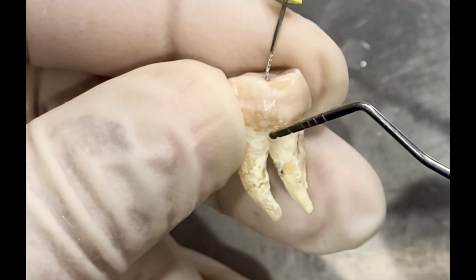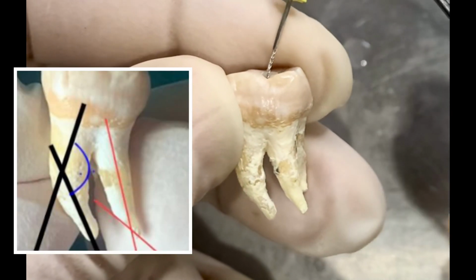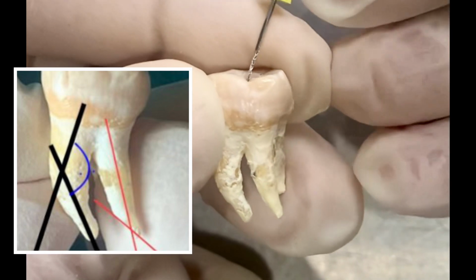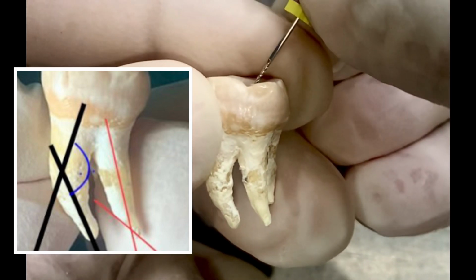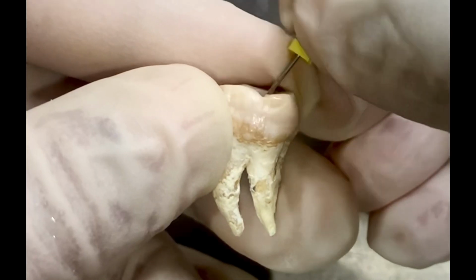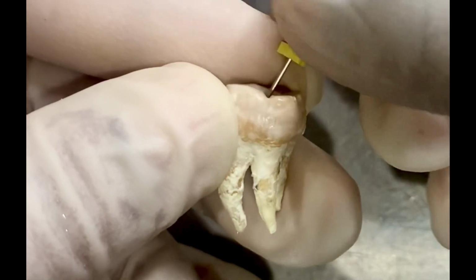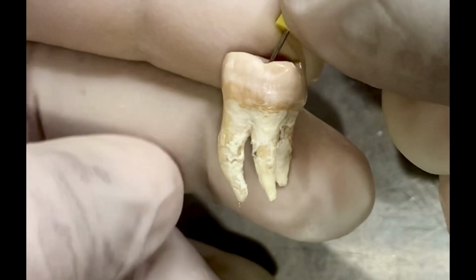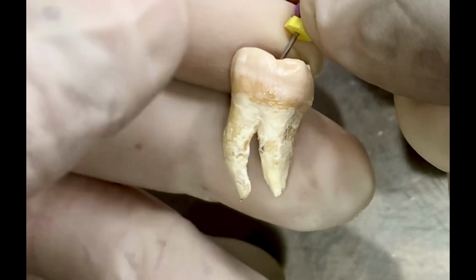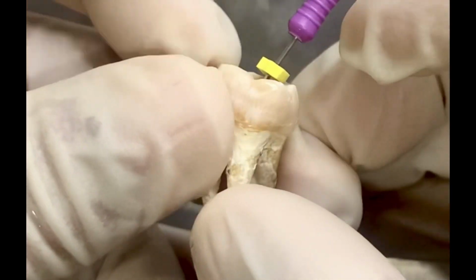In this tooth, the mesiobuccal root is curved in the middle 1/3. In such a case, it is always easier to approach the canal by tilting the file downwards towards the occlusal surface, like this. And then, slowly, with to and fro motion, move the file through the canal till you reach the apex. Now here you can see the file has moved beyond the apex. So we withdraw the file till we reach the apex and we mark with the stopper.